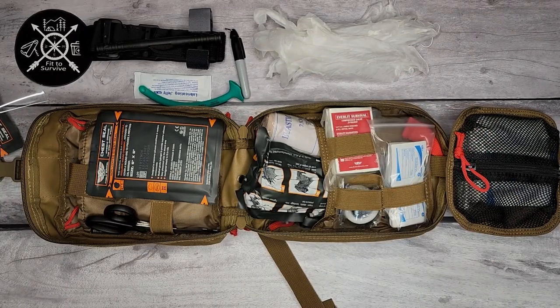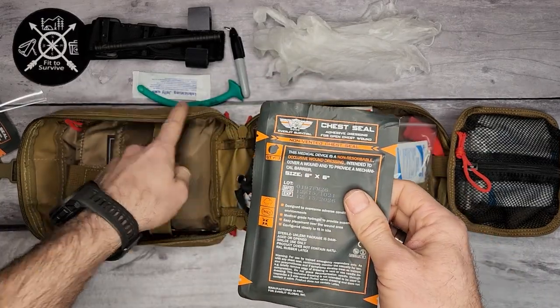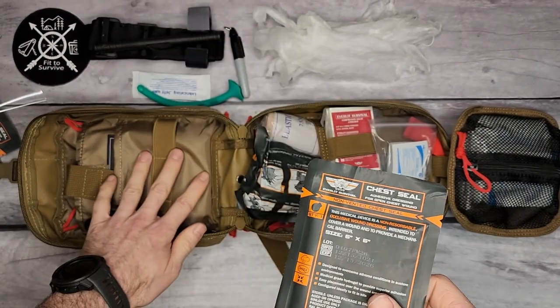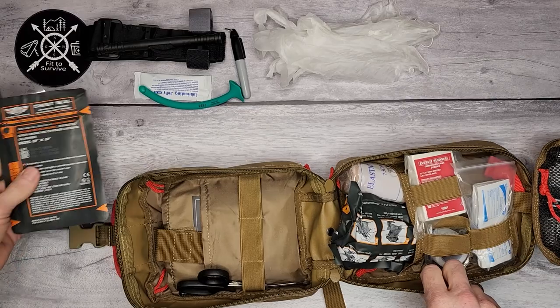A lot of the items coming out of this kit are Everlit Survival's own brand. This chest seal is also their own made product.